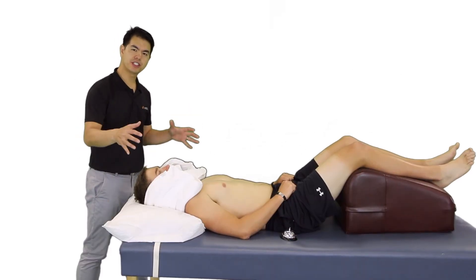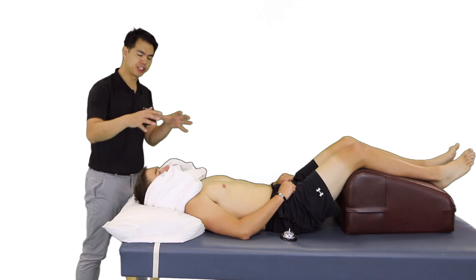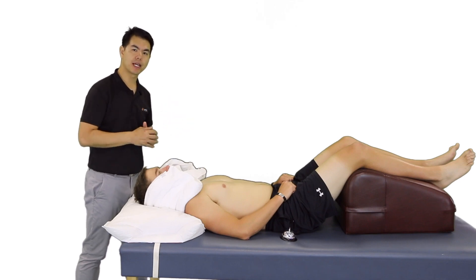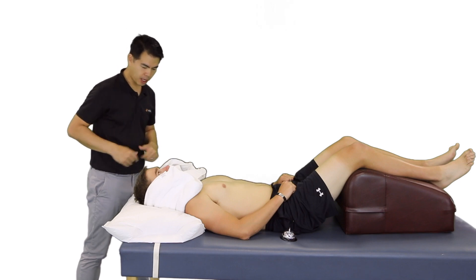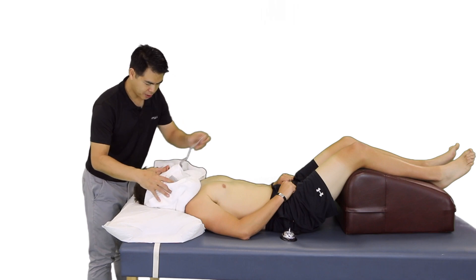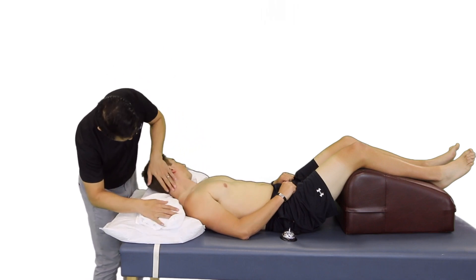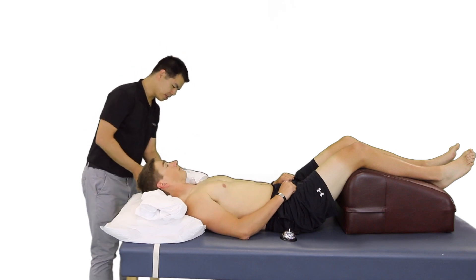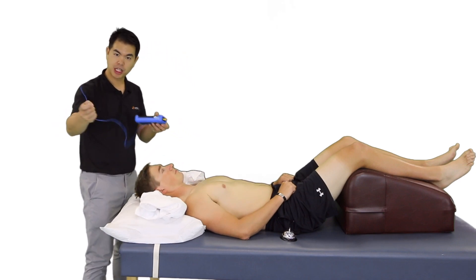After five minutes, it's important to check on patient comfort and to adjust the towel layers or hot pack covers to ensure you're at the right therapeutic temperature. I'm going to unwrap this and take a look at your skin — it should be moist and warm. We can also use a surface thermometer to check the temperature.